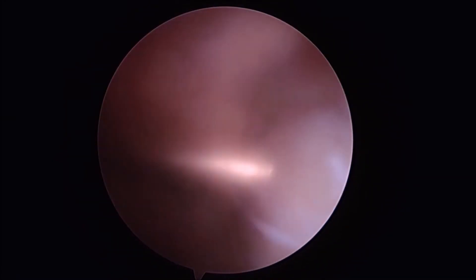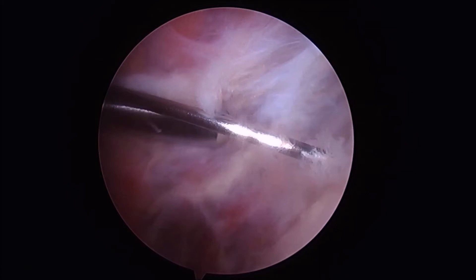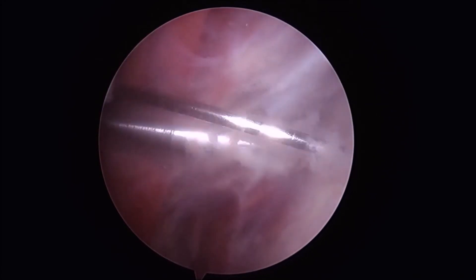The guide pin is introduced through a lateral portal and mounted into place. The mechanical shaver is then used to remove any fascia from around the guide pin to allow for smooth entry of the graft over top of the pin.